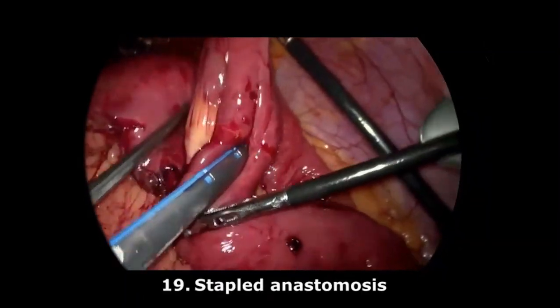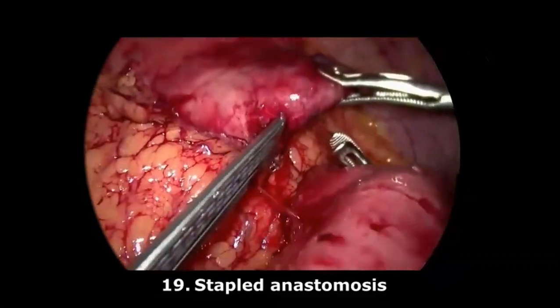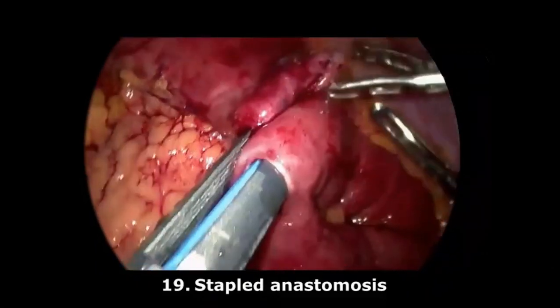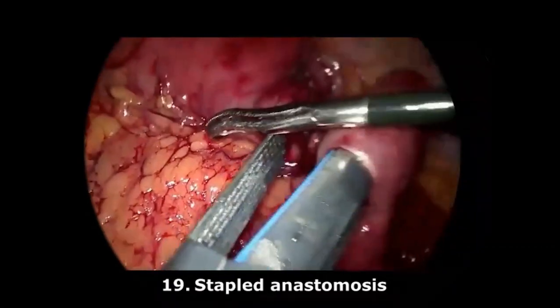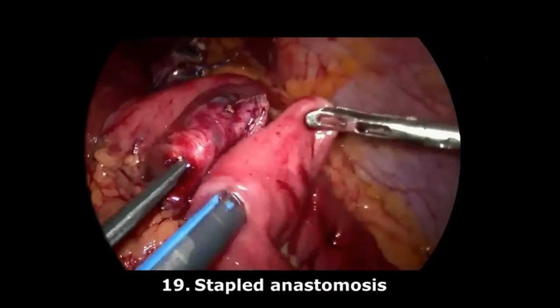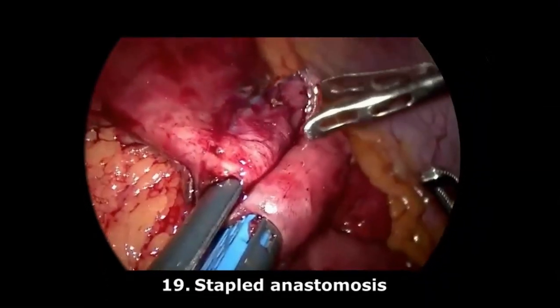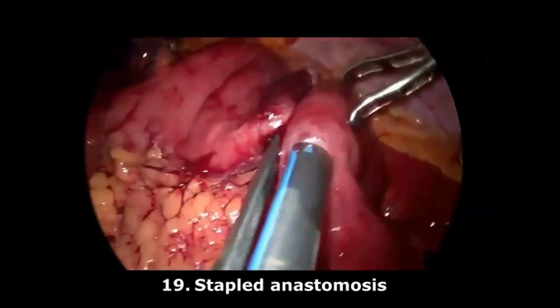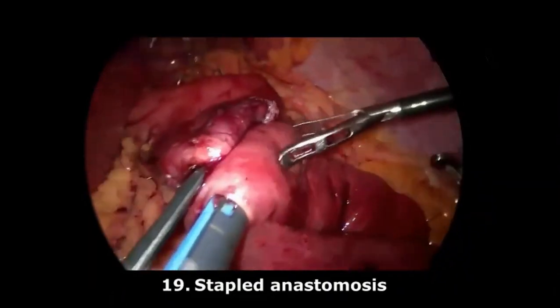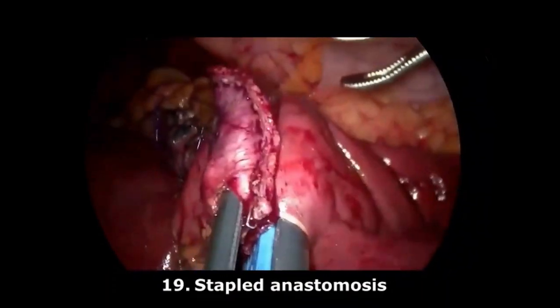Now the stapled anastomosis. We always advocate the stapled anastomosis. The stapled anastomosis is done with the posterior aspect of the duodenum. It is a 3 centimeter stapled anastomosis. It is dependent because it is done with the posterior aspect of the duodenum. This can also be achieved with the hand-sewn anastomosis, which is done with the anterior wall of the duodenal stump.